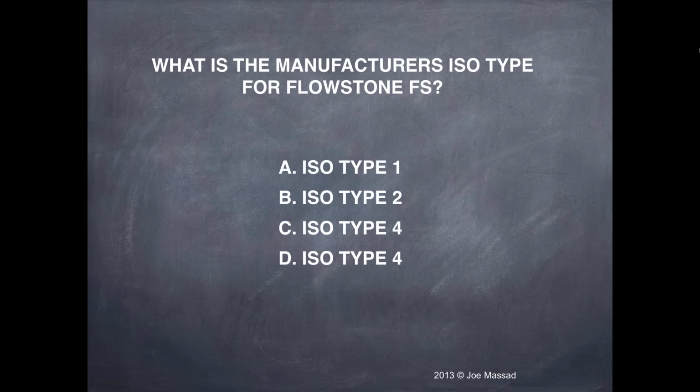Our final question is, with your technique, how easy can you remove and put back the soft tissue part in its accurate place? Well, you know, we've had no issues. I know that there was a time we would put more of a kind of anatomy, or we would carve a little bit out to make sure that the soft tissue material would adhere and not move around. And that's a good question.